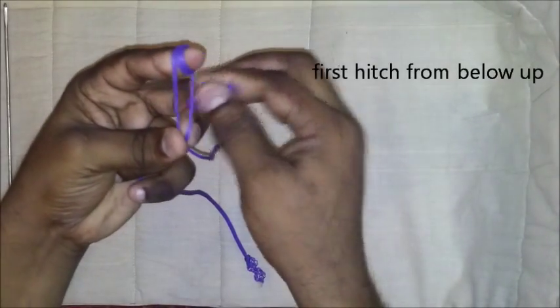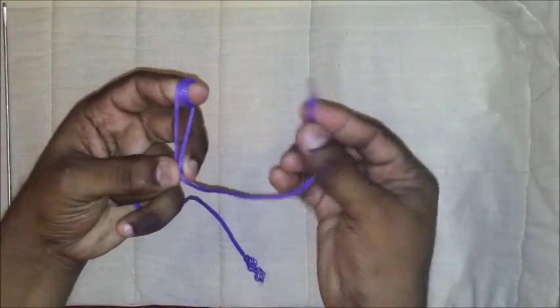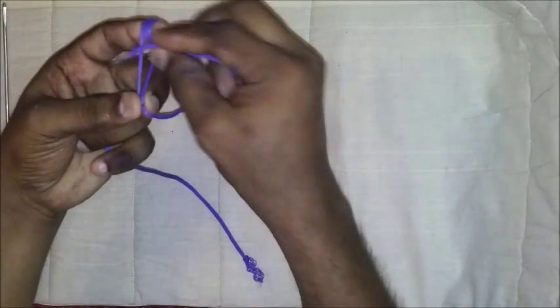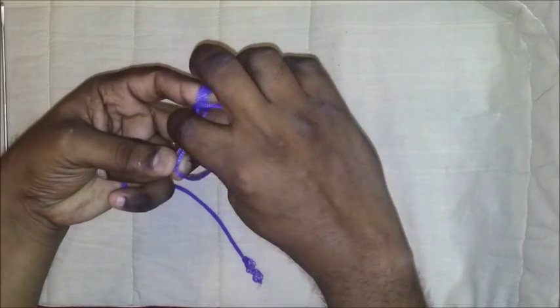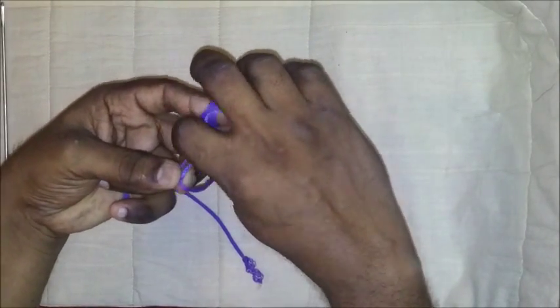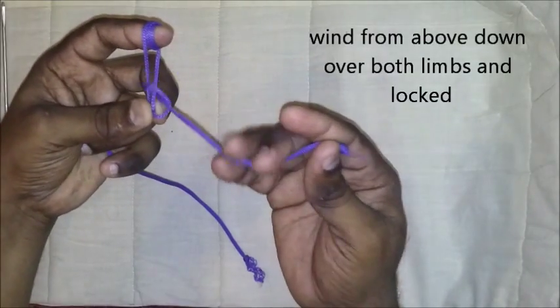I will take the first hitch from below up. Then I will take a wind from above down unlocked like this.